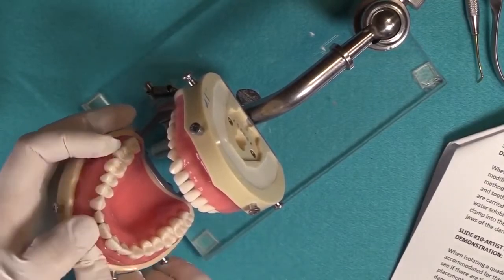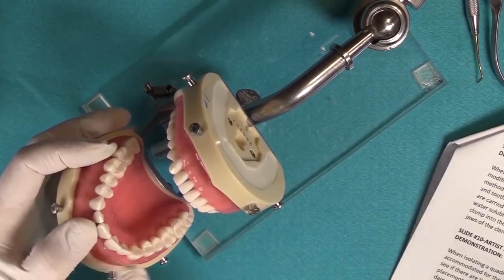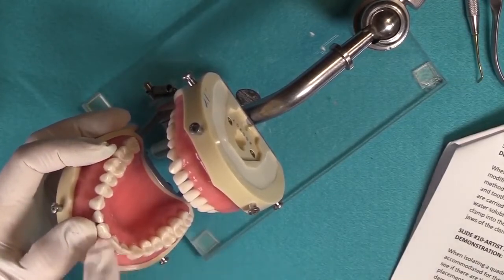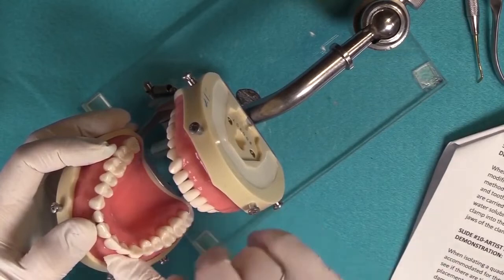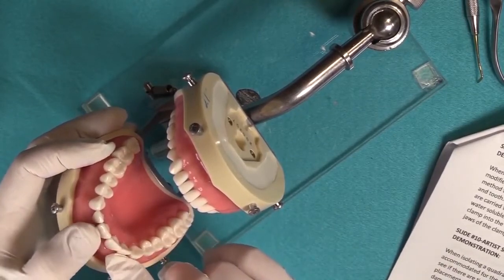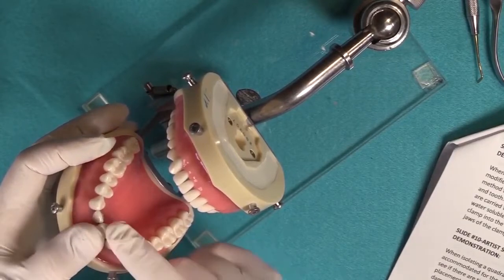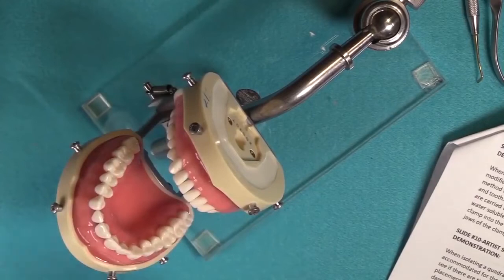We're going to be placing a retractor clamp on number 9, and the reason why we go a few extra teeth across the arch is because normally the retractor clamp is placed so that it's stabilized. Now, I know some individuals will stabilize it using a green stick compound, which is a technique we learned years ago. I think some schools still teach it.